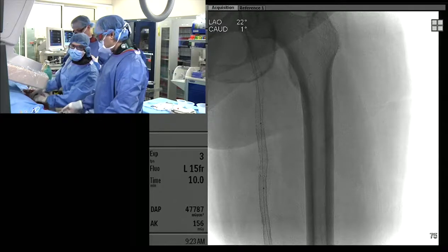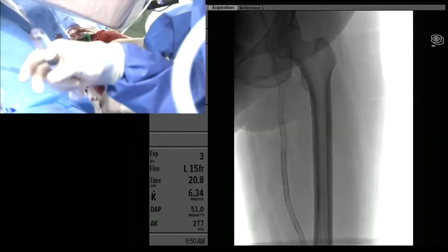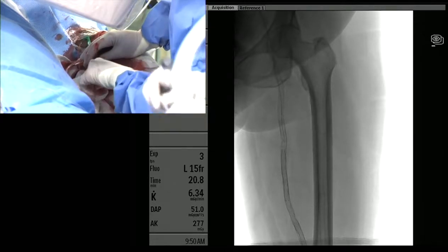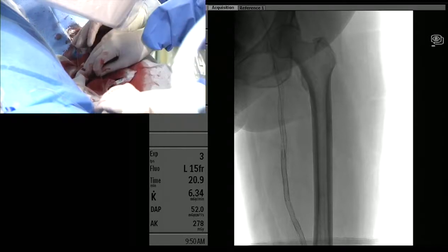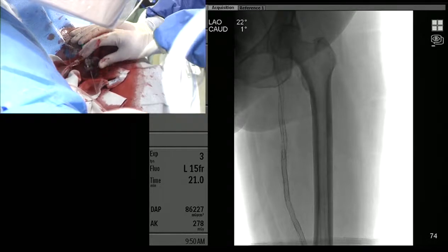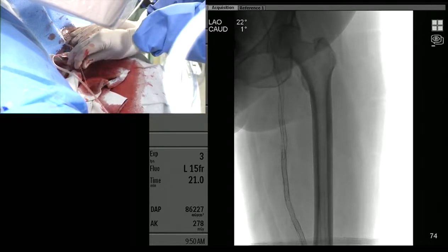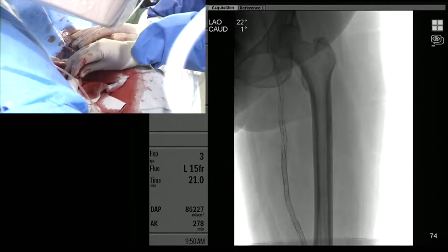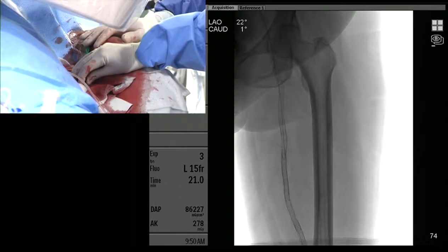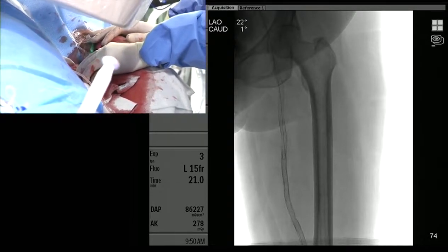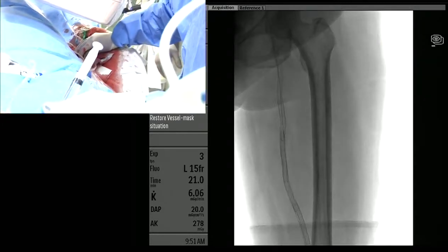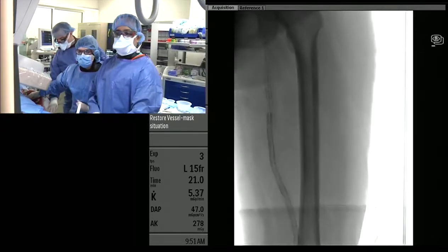We had to remove the 2A because we could not reach down there. What we ended up doing was actually re-stenting that segment. The DCB did not fit through the six-French guide, even though it should have. So we re-stented that area — took it to 6 millimeters — and the angioplasty alone didn't really change much in the area of the new stent fracture.